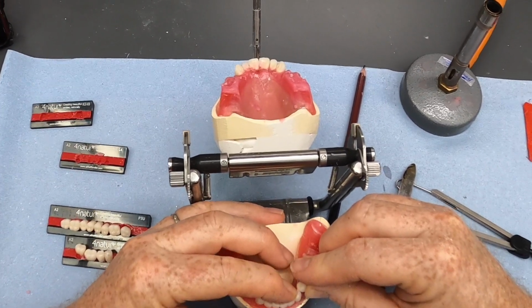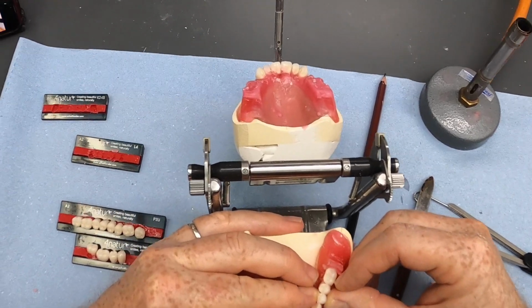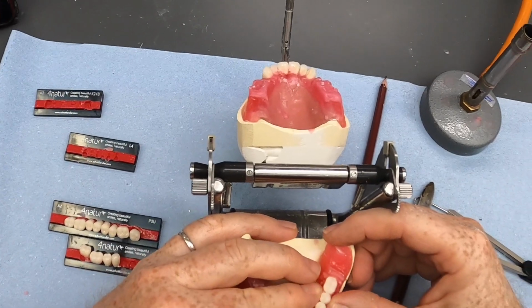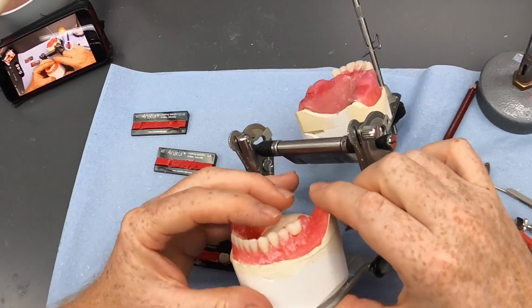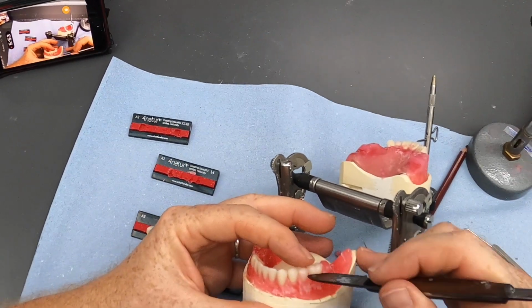We're going to fit that in. Just get that canine out a touch. Premolar in, and we're just about there, I think. Let's check that we're sensible when we look from the buccal aspect.